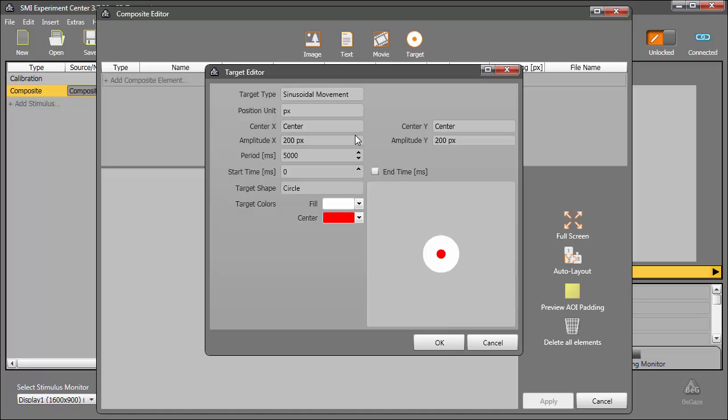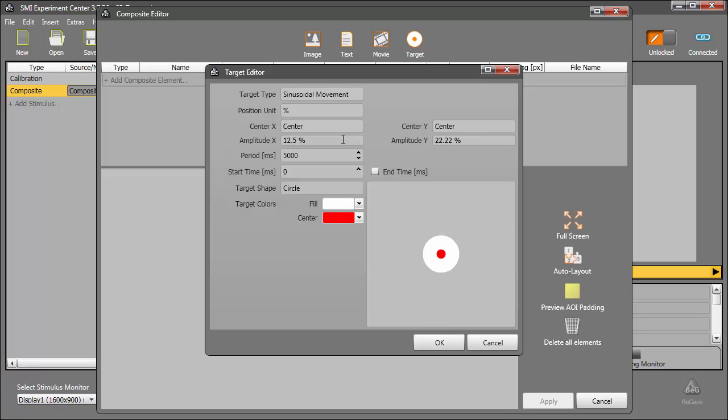For consistency, I'll change the position unit to percent, and start it at the center. Next, I'll set the amplitude along the x-axis to 33%, and the y to 0. This will move the target in a sinusoidal pattern horizontally across the screen. Let's keep that up for 4500 milliseconds, starting right at the beginning with the default circle.